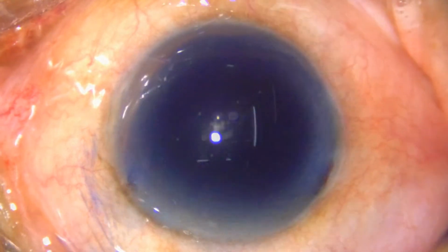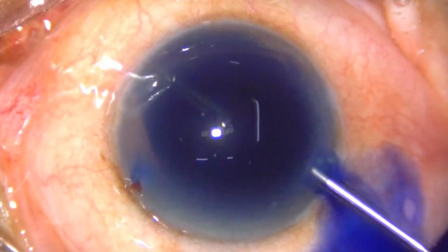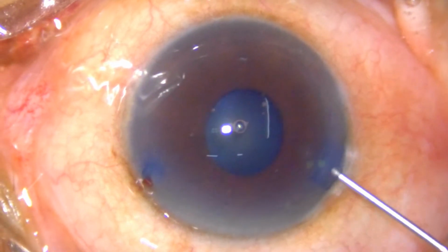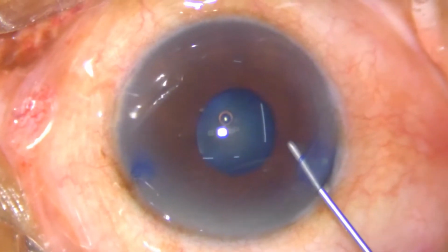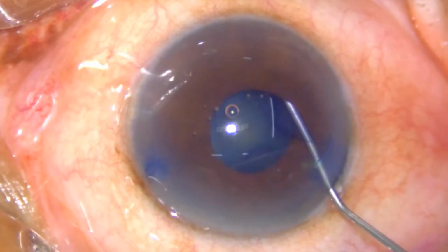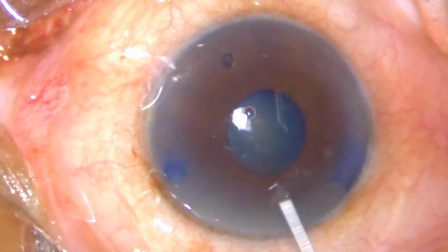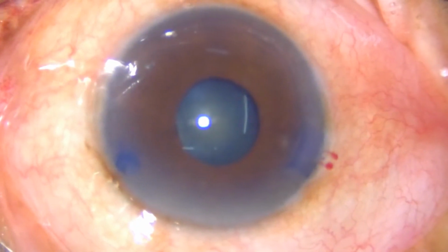Go below the pupil margin and inject the trypan blue dye, so that the capsule is stained even below the pupil. Wash away all trypan blue from the anterior chamber and from below the iris.